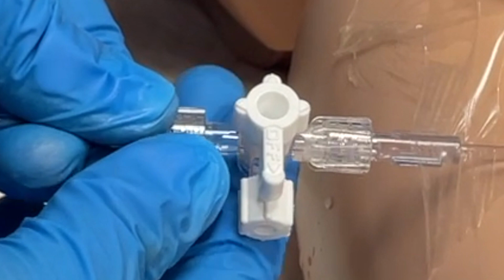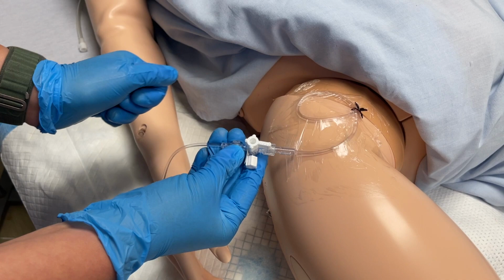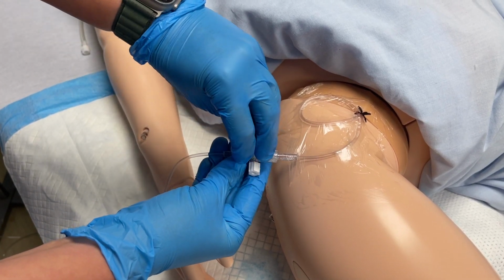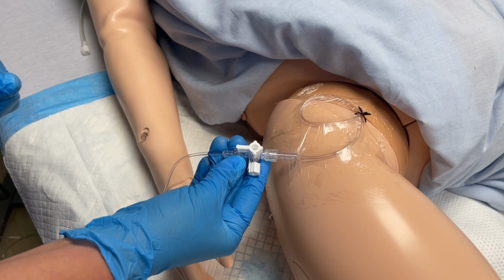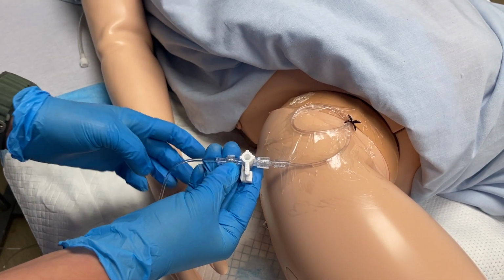When looking at the device, you will notice a lever. The lever has letters on it indicating off. Whichever way that lever is pointing means it is off. When the lever is pointed towards the access site, we consider that off to the patient, meaning that there is a lumen open on the open port that you see capped here and the transducer set, which we will get to in a minute. Alternatively, when the lever is pointed away from the patient's site up the transducer line, we consider that off to the line. Whenever it is in the neutral or capped position, we call that off to the air. While we are monitoring the patient, all stopcocks need to be in the off to the air position.